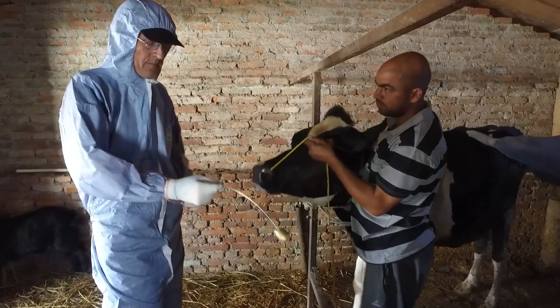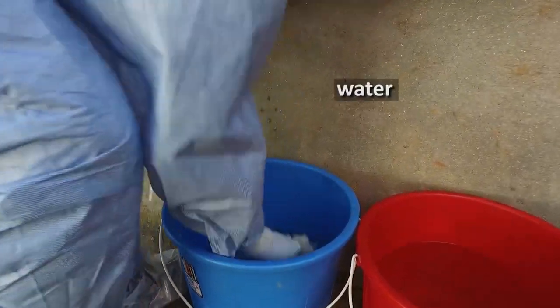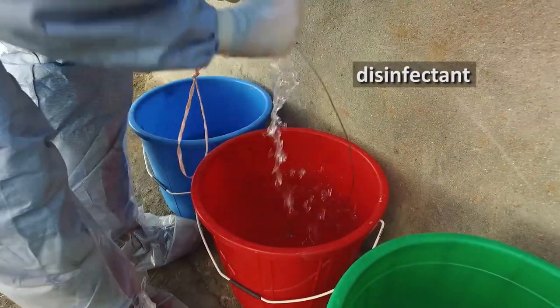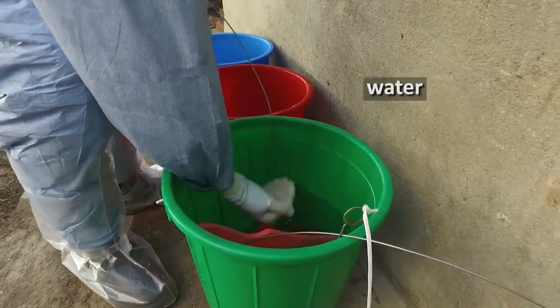If you need to take multiple probang samples from different animals, the probang needs to be cleaned and disinfected between each animal. To do so, use the three-bucket method: wash in water, disinfect with citric acid, and then importantly rinse off the citric acid in a third clean bucket of water.